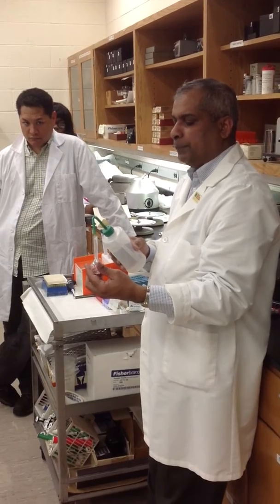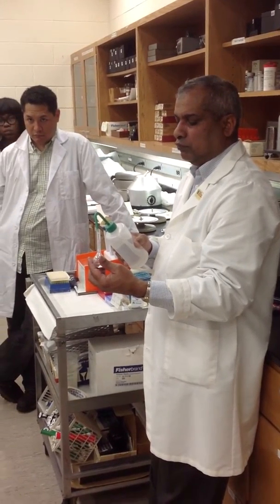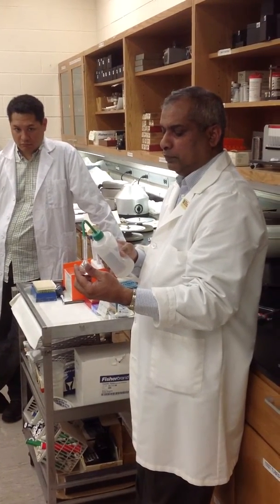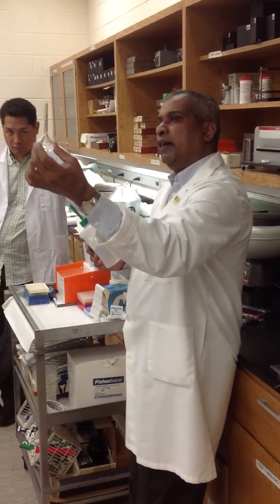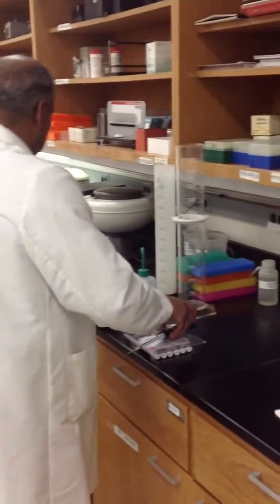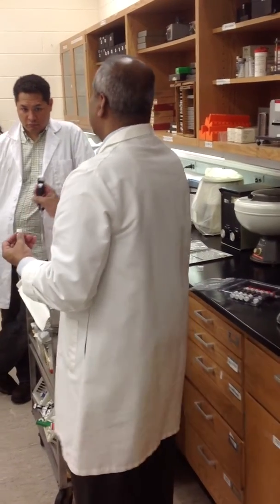So what I do is put some saline in there, about half or so. And then I'm going to add my blood. Okay, so I set it.